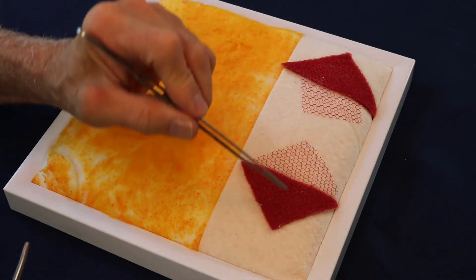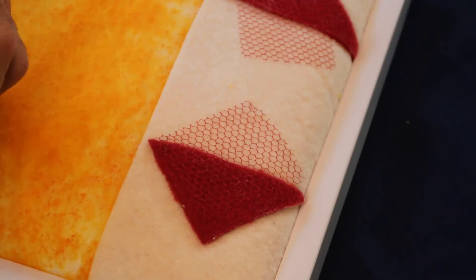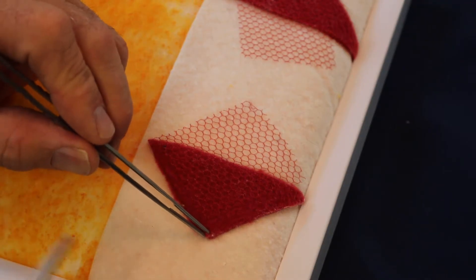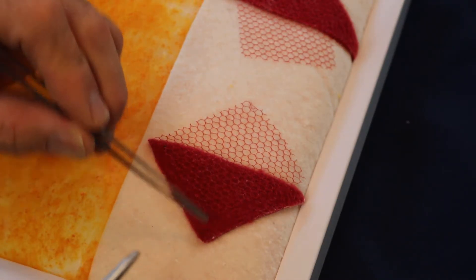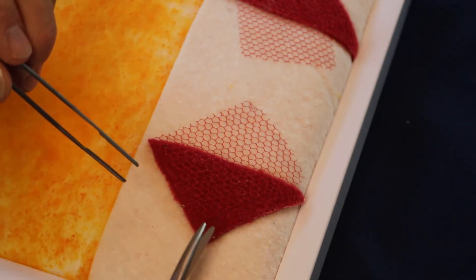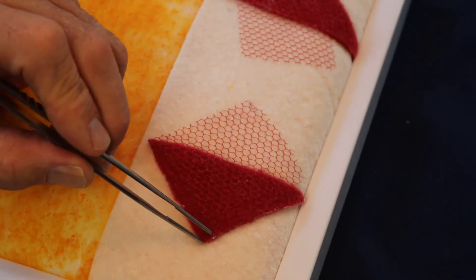The goal is to accurately separate these tissues. Let's begin with a piece of red cloth attached to the simulated fascia. To remove this, we will need to use our forceps to retract superiorly and away, and then with small cuts and spreads with the Metzenbaum scissors, gently define the plane between the different materials.